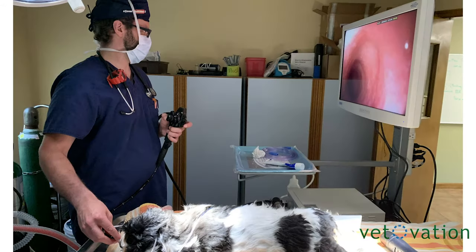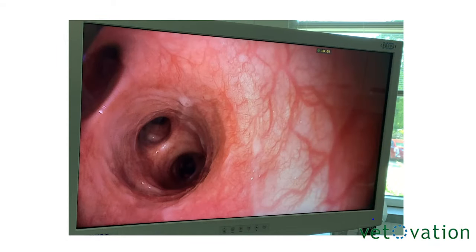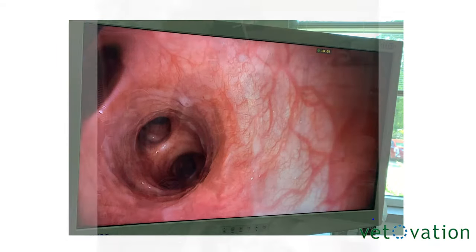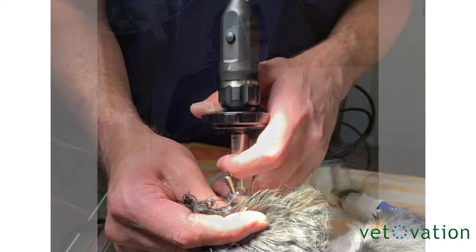One of the unique features of the system is the ability to exchange your flexible scope for a camera head that attaches to a rigid scope. This now enables you to perform video otoscopy, rhinoscopy, and cystoscopy with a rigid scope.